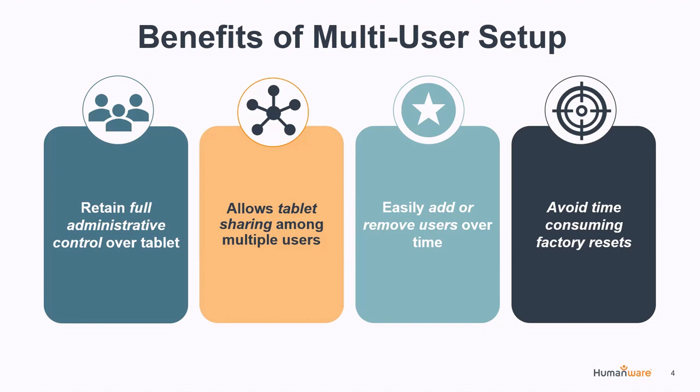And lastly, again, if you have an individual user set up and you want to set up the tablet for use by another individual, you would then have to perform a factory reset to wipe everything that the first user did for the second user. In this type of setup, you don't have to do those factory resets. You simply remove a user, add a user, and go on about your business.